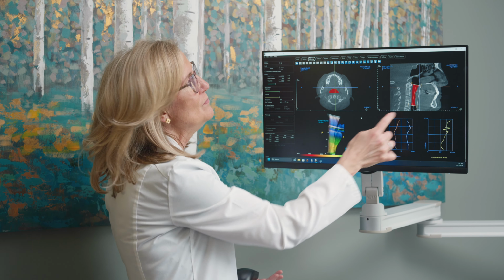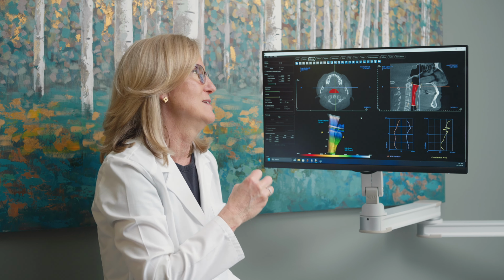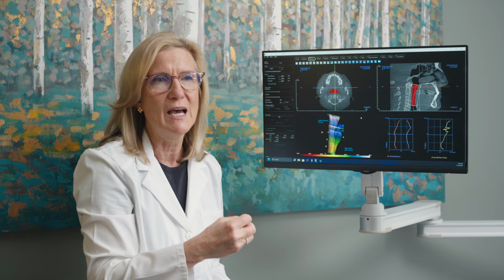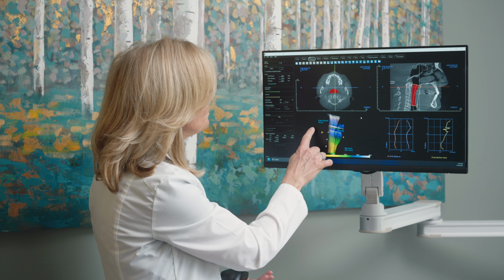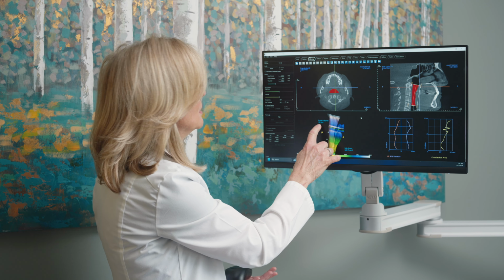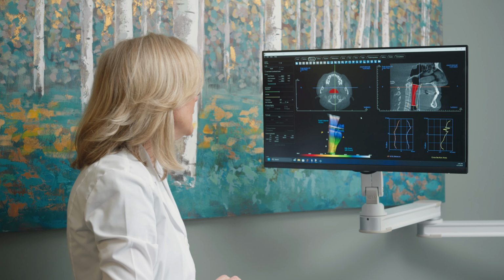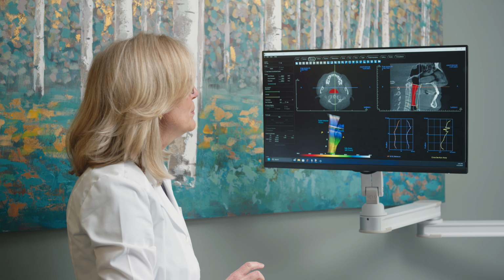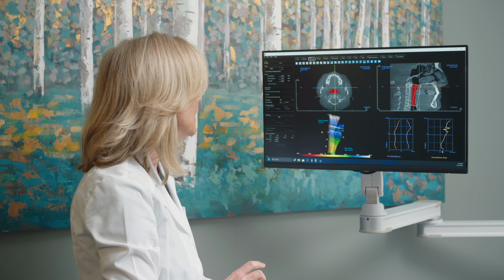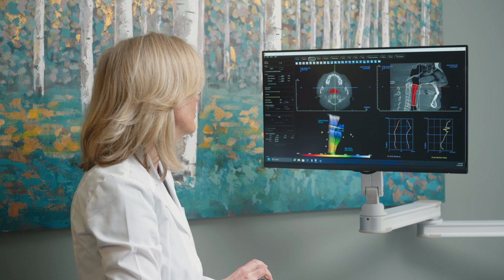So here, you can measure it, and they don't say that this is definitive data for size, but it is helpful as an example to see what I'm talking about. So total volume is 19.3 cc's. So I'm going to bring up another person to show you the difference between tongue on the roof of the mouth and tongue not on the roof of the mouth.